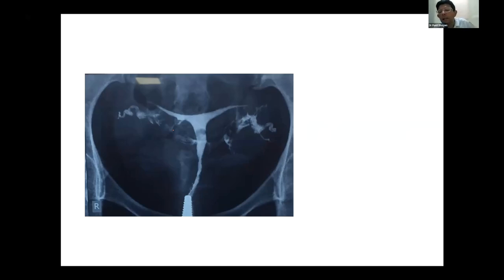Anyone else? Very good, Ishira. So this is clearly a T-shaped uterus, as we would call it. Various reasons for that are there, but you can see that the normal uterus should have been like this. It is T-shaped, could be adhesions. See this much part. The triangle that we are drawing, this much triangle should have been there. So all these parts, definitely this.